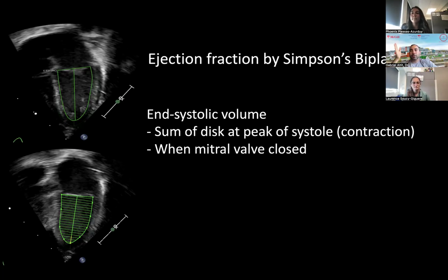Some of the studies, mostly done in the congenital heart population, found that the 5-6 method might correlate a bit better with MRI values. And there's also slightly less inter-rater variability compared to the assessment of LV function.